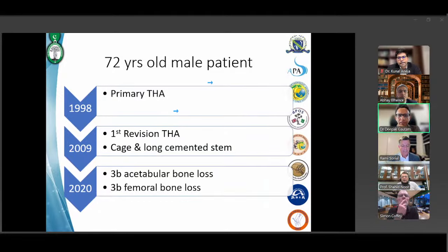Dr. Noor, the cement was very loose there. Sorry? The cement was loose. A big fragment of proximal cement was loose. The distal cement we had to remove, but yes, the proximal cement was loose.